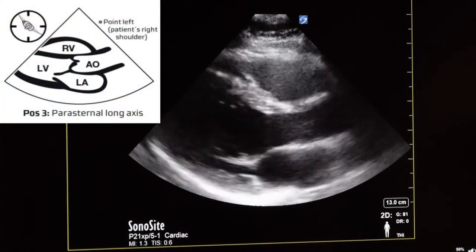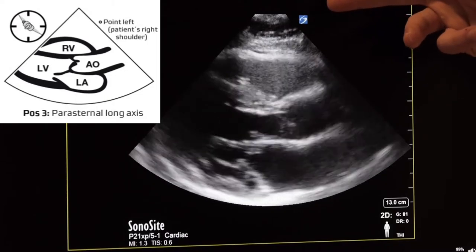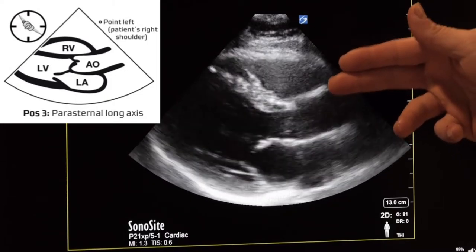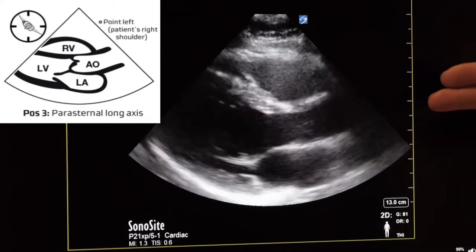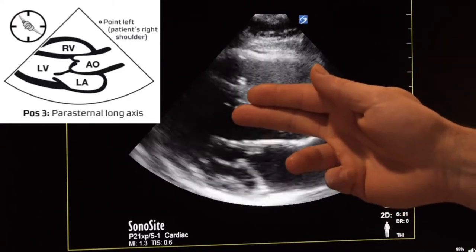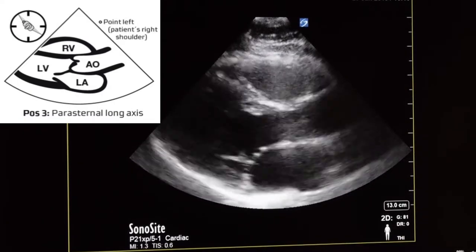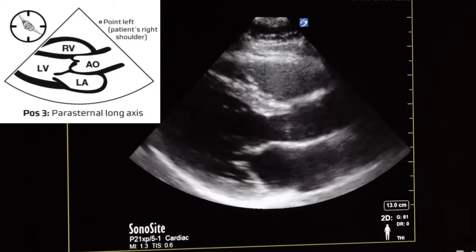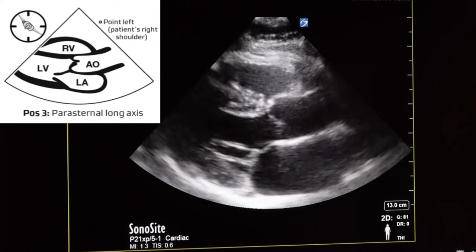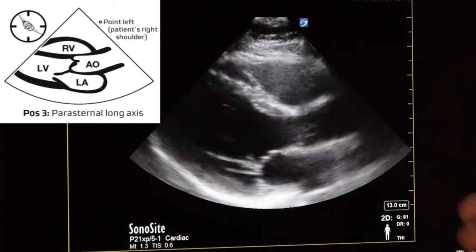This is our parasternal long axis view. The right ventricle is visible here, and going down you have the aortic valve and the mitral valve. This also opens up our left ventricular outflow tract — from the left atrium into the left ventricle and out through the aortic valve. This view is great for evaluating overall cardiac function and both the left and right sides. Looking at the right side of the heart allows us to evaluate for pulmonary embolism, and we can also further evaluate the aortic and mitral valves.